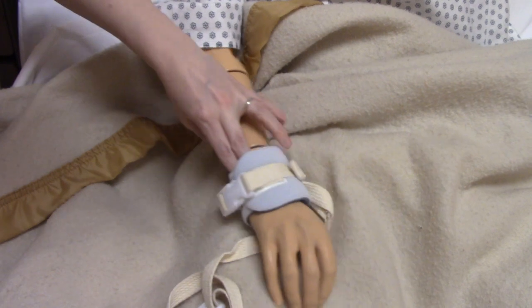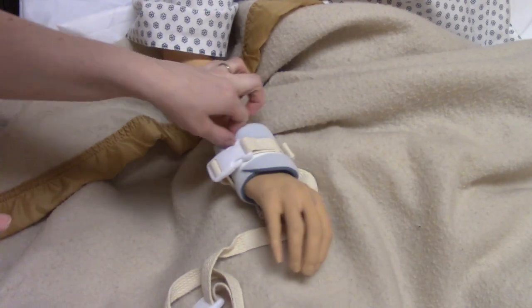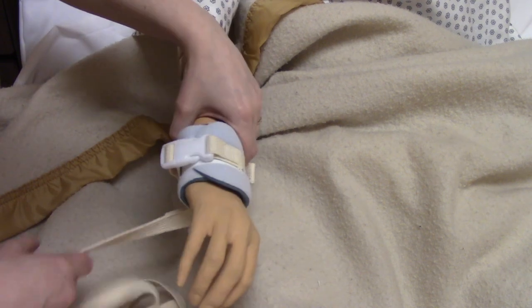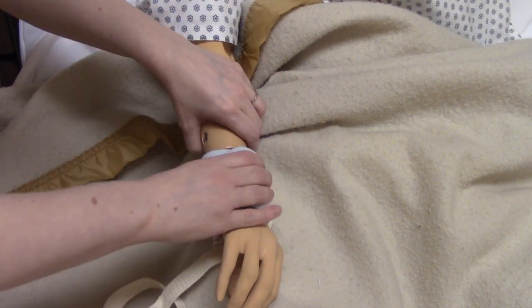If it's too loose, you could fit a lot more than two fingers underneath and then it could fall off or the patient could get out of it easier. So you want to make sure that it's tight enough but not too tight to cause harm.